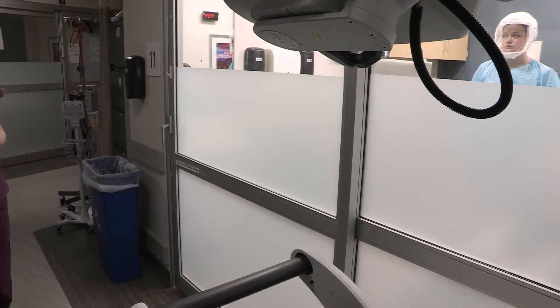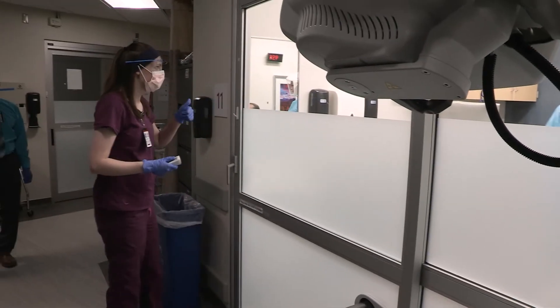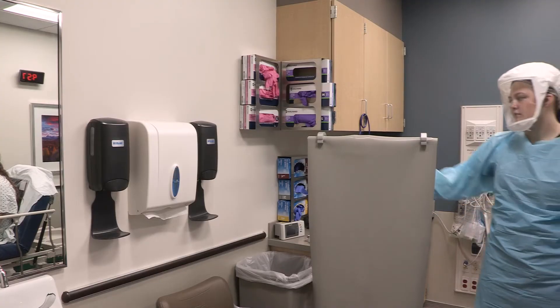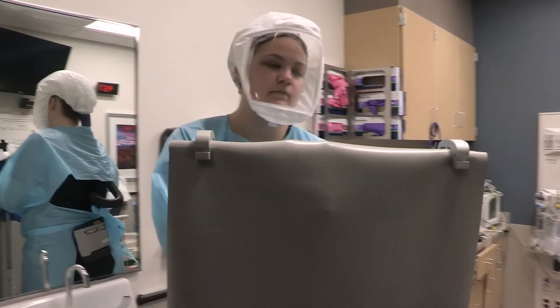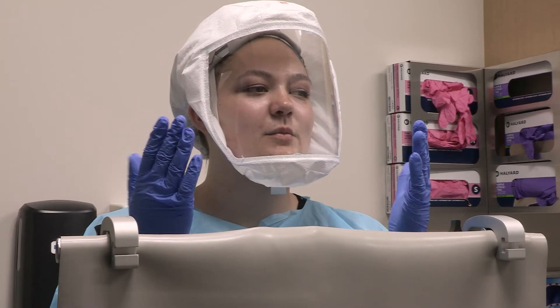The technologist will move six feet away from the x-ray machine and give the nurse a hand gesture, such as a thumbs up, to indicate they're ready to take the x-ray. The nurse will move into the corner of the room, ideally six feet from the patient, and position the lead shield between the patient and themselves. The nurse will then give the patient the following breathing instructions: take a breath in, blow it out, take another breath in, and hold it.